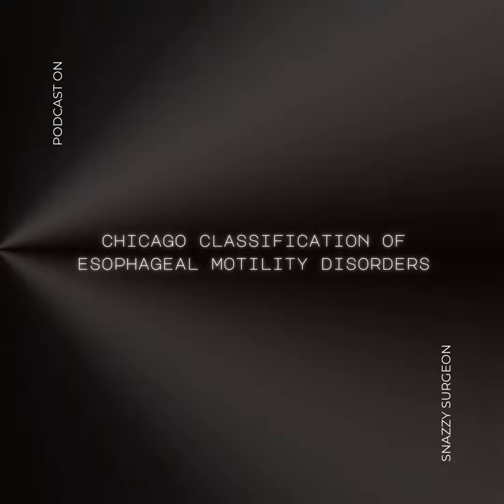Is that all we need to know about peristaltic disorders? There's one more category we should mention called absent contractility. Pretty self-explanatory. This one means there's no measurable contractile activity happening anywhere in the esophageal body. It's another distinct type of peristaltic disorder in the Chicago classification. Absent contractility, yeah, that was pretty clear-cut.